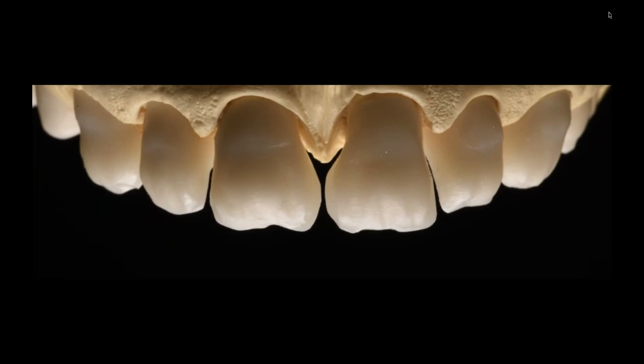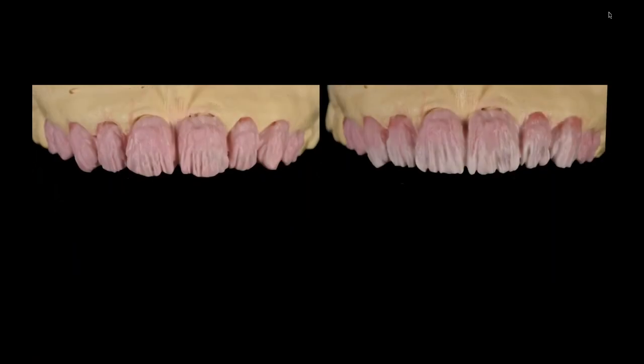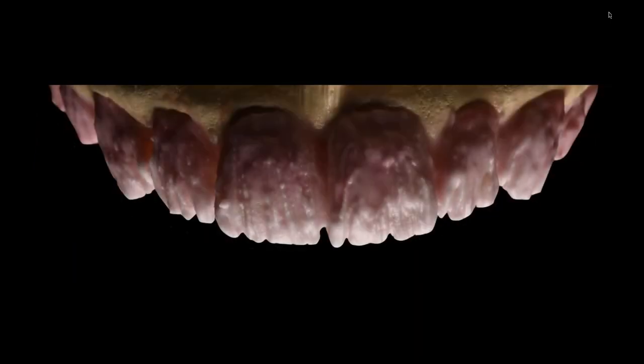You'll notice that we're building much more structure out of the zirconia itself. And we're doing this because we want some areas to be more light reflective. And we're actually using the zirconia base as part of the process for the ceramic layering. So now the dentin becomes a little bit simpler. I don't need as much dentin. I can go straight into my translucents or my enamels, whichever I'm going to use.